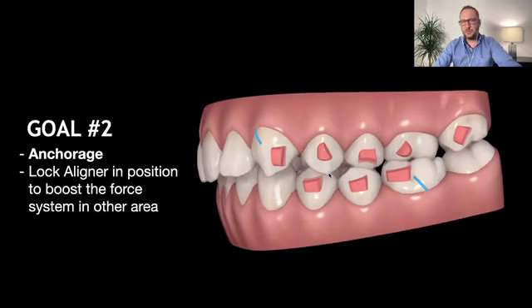For example, a class 2 where we are going to use an elastic. Let's start anticipating the topic for the next webinar. When we see these cuts here, these blue lines, it means there is going to be a cut in the aligner where we can fix the elastic, okay? Don't worry about this right now. Let's discuss more next week, in the next webinar, okay? But we just need to move the uppers back, distal, and we don't want the elastic to pull out the aligners here.